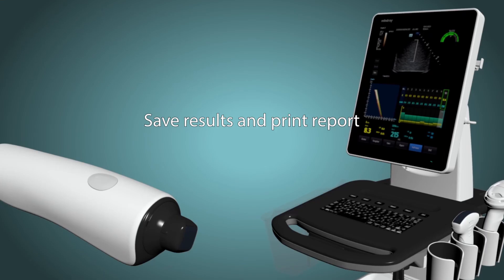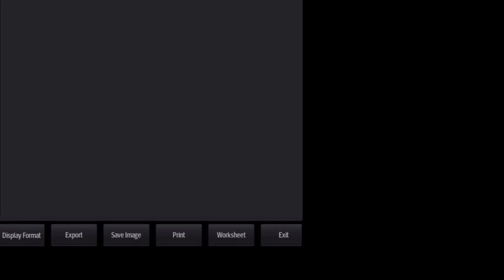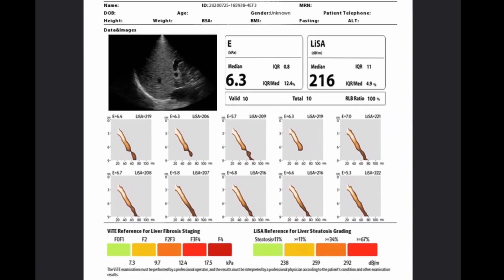The next step is saving the results and printing the report. Simply click the save result button on the screen, and then you can preview the report in printing mode. Remember, you can always start a new measurement if the current results aren't acceptable.